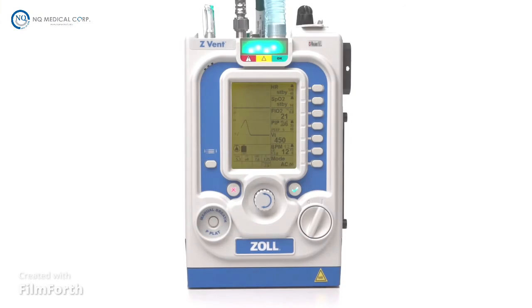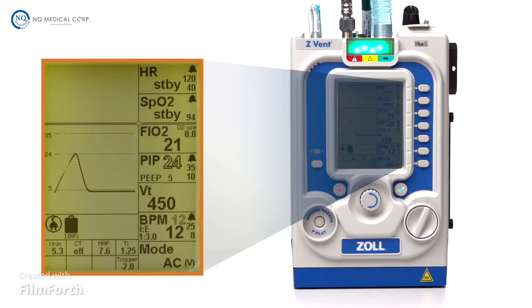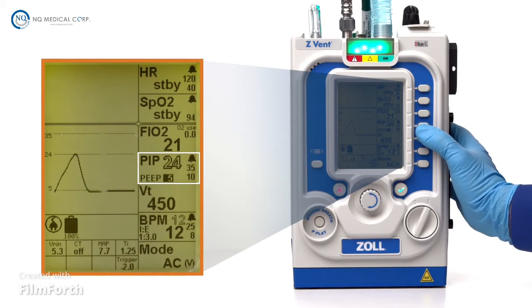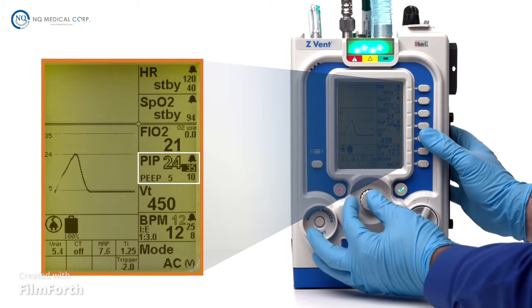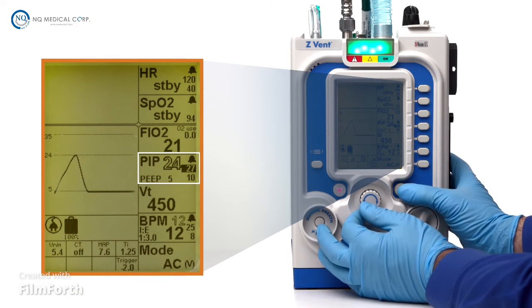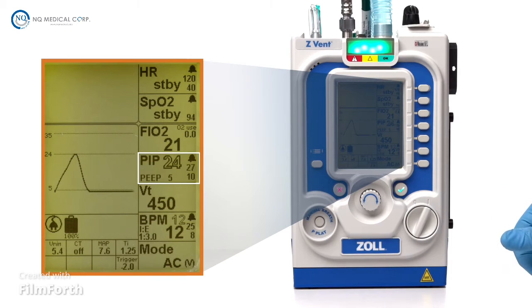To adjust a parameter, begin by pressing the parameter button adjacent to the desired window. Notice how the setting within the parameter window is now highlighted. Each press of the parameter button cycles through each setting that can be changed for that parameter. Use the parameter button to cycle through settings until the desired value is highlighted. Use the selection dial to adjust the value up or down as needed. Once the desired value is reached, confirm the change by pressing the Accept button. The parameter is now changed.